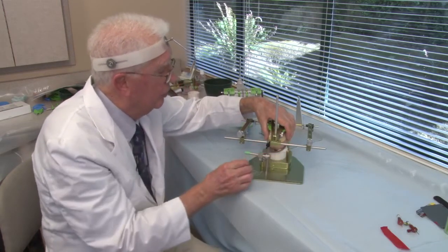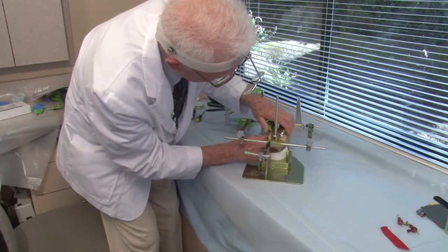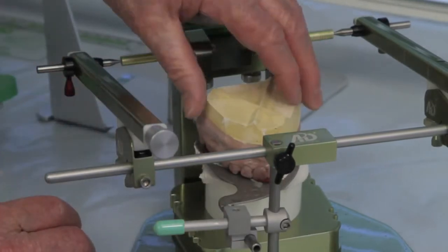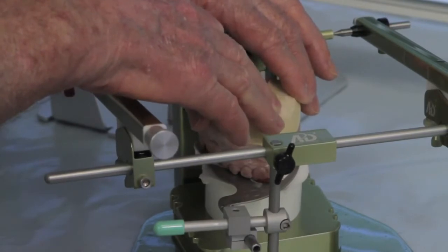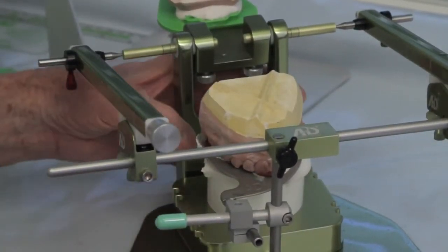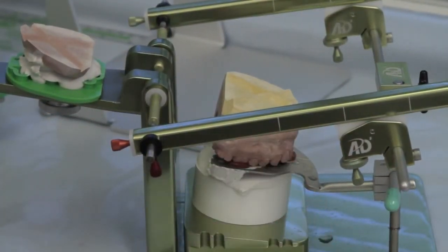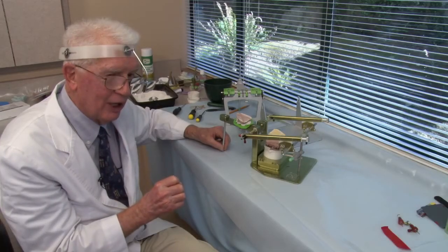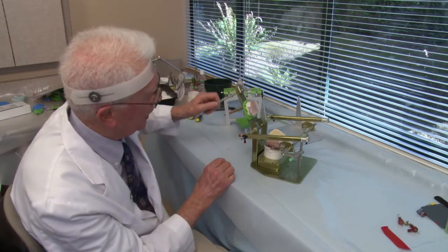The first thing I want to do is just hold the model and lift it and open the mounting stand, leaving the model in place. Now I'm going to check the model, see that it's seated good. Now I'm going to close the hinge axis mounting stand again and see if I split cast check. In other words, I'm asking myself, did I move that upper model when I mounted it? The only way I know for sure is to close it down.